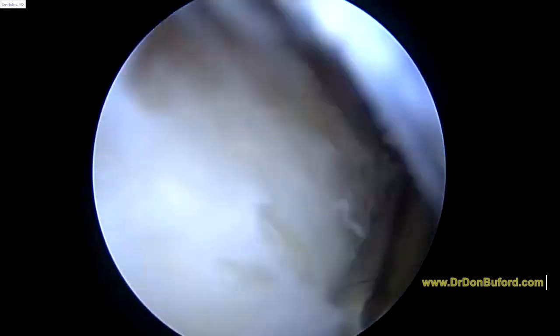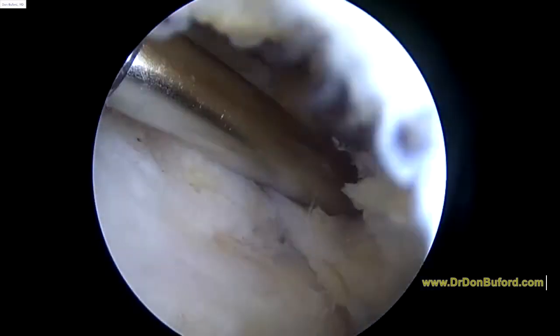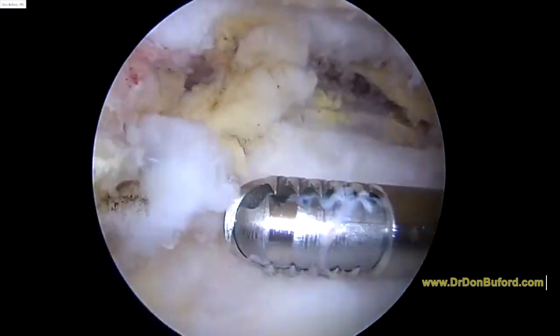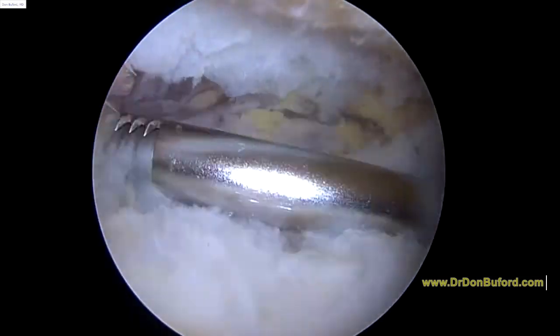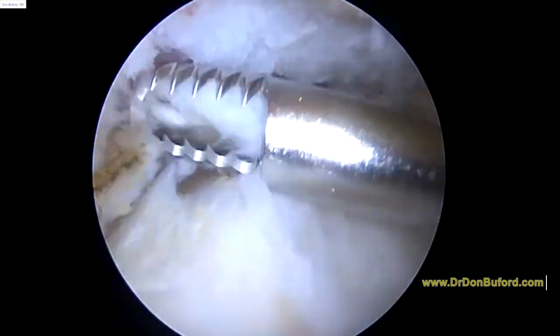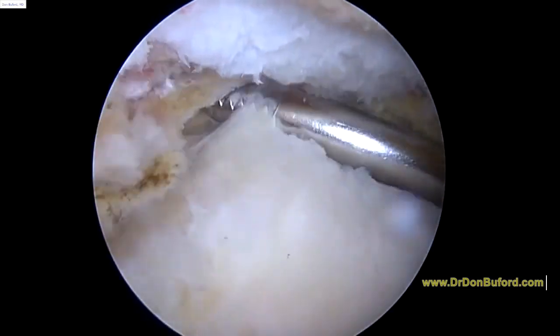So I think this is going to turn out to be good news as far as not having to do anything surgical through the rotator cuff. We're going to finish up removing some of the scar tissue and some of the synovial tissue and get you back to the recovery room shortly. Good luck to you now. Bye-bye.